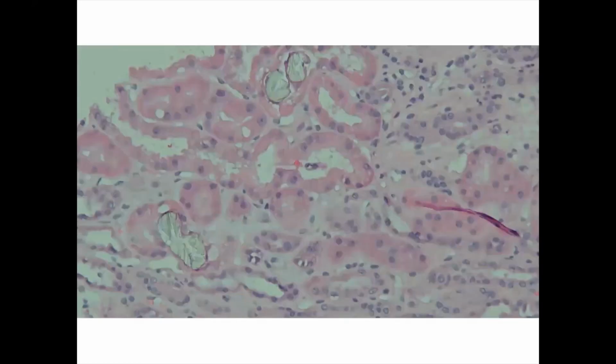The serology tests are all negative. Yeah, complements are normal. And this is what we see. His glomeruli are absolutely normal, and let me tell you the IF is negative. What do you guys see?